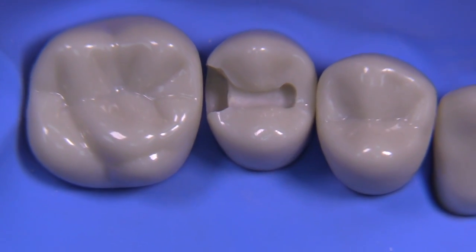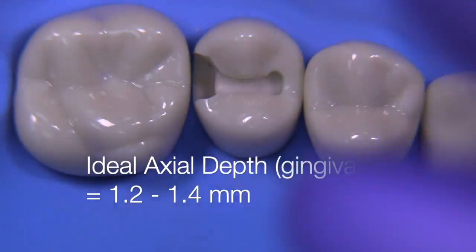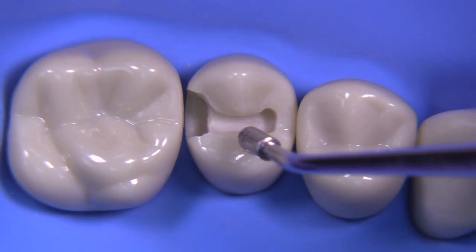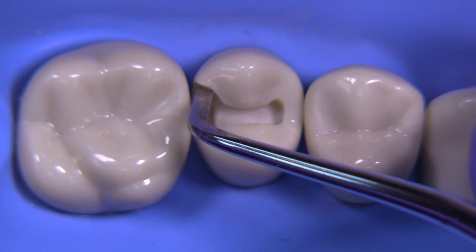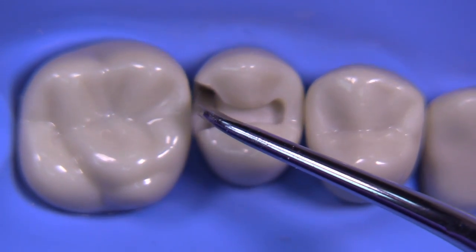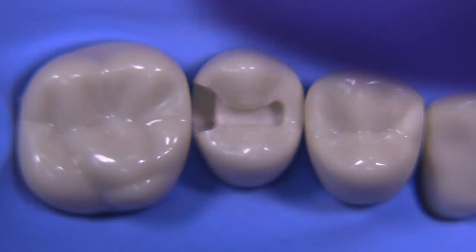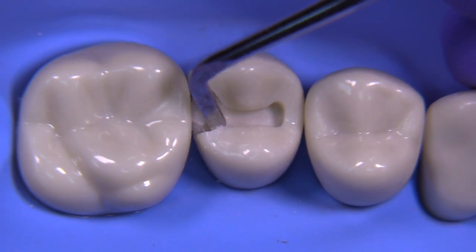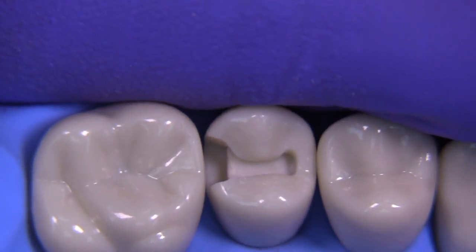You can see the preparation is nearly complete. It's a good idea before you're finished to check things. The axial depth or gingival width is less than 1.5 and it was more than one in the previous instrument, showing you that we're looking for 1.2 to 1.4 of axial depth — or gingival width if that's easier to understand. The hatchet can be used to do a little bit of cleaning up. Watch your time and make sure you're not going over, but this would be a good time to spend doing some refinement and cleaning out the debris in the preparation. Don't leave debris behind — blow it out or use a Q-tip or some alcohol or a surface cleaner.